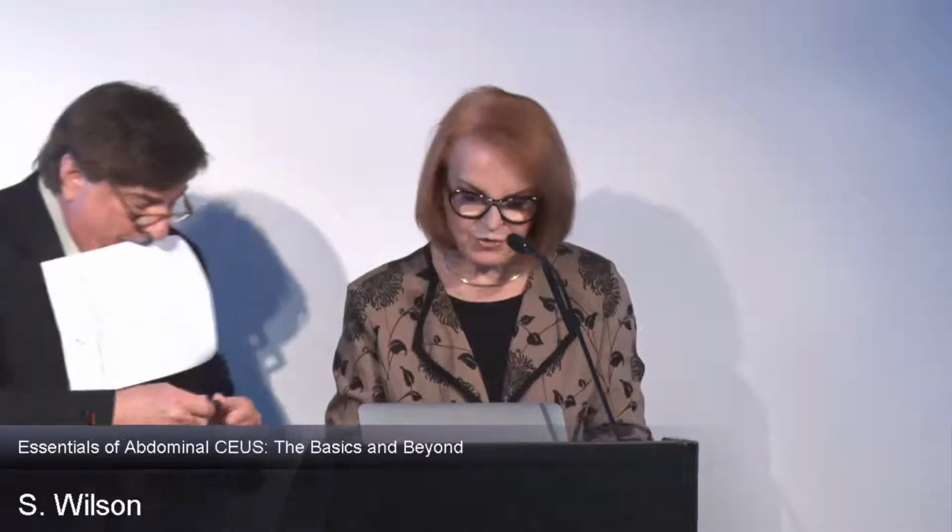So I'm going to speak now about a talk I call Tips of the Trade. Richard mentioned many things that I have in this presentation, but I'm going to show you how they look when we're actually doing the scans. And I think that's a bit helpful.